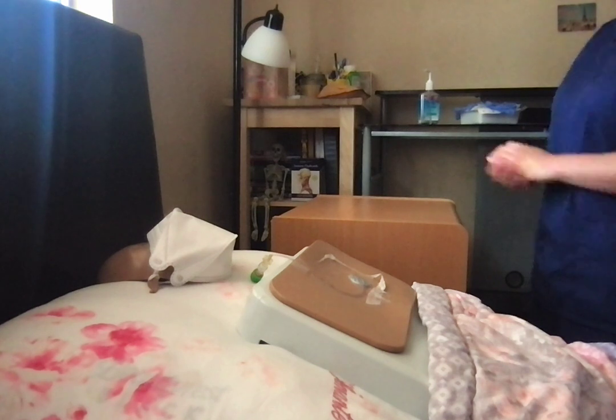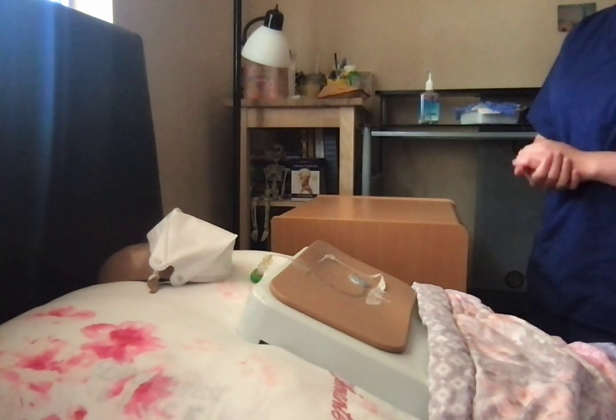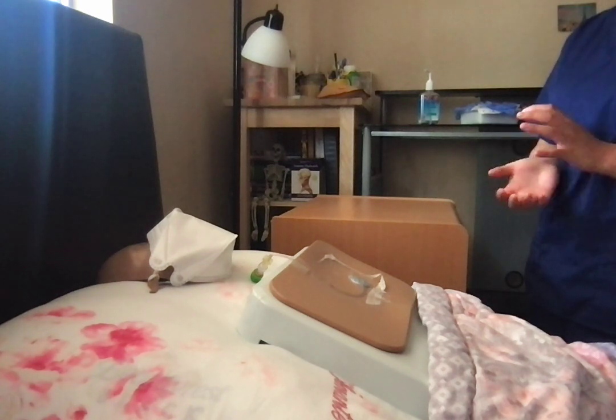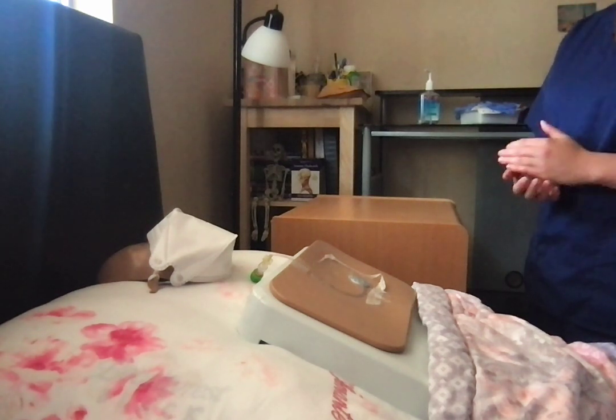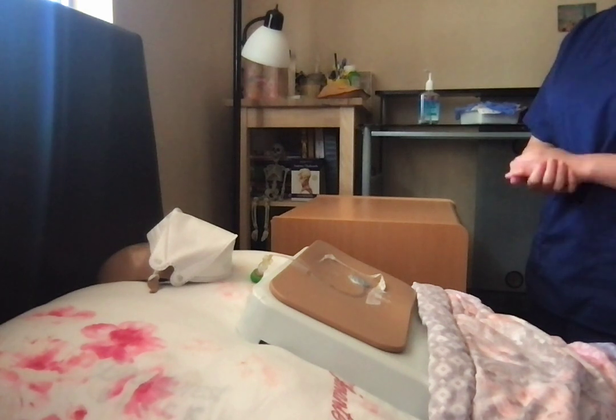It's a fairly simple procedure. I'll gather my supplies, I'll remove the old dressing, I will look at your skin and the tubing, and then I will put a new dressing on for you. Do you have any questions or concerns? No? And are you experiencing any pain? No pain?